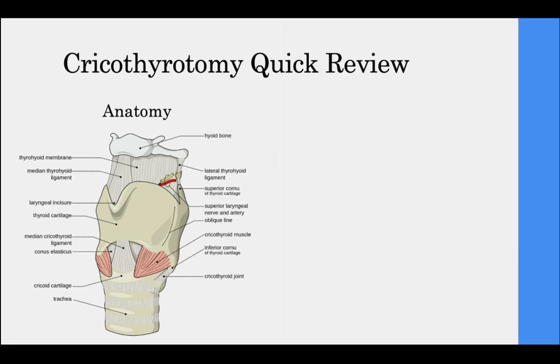We're aiming for the cricothyroid membrane because it's the biggest area that I can get without cutting through tracheal rings. If you go a little low and you cut through a tracheal ring, no problem. You've now done not a cricothyrotomy, but a tracheostomy, and that is still a valid surgical airway. So stay away from the no-fly zone, walk down midline, or do the 4 fingers up.